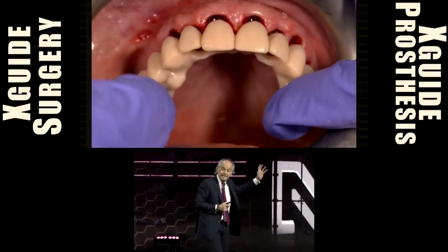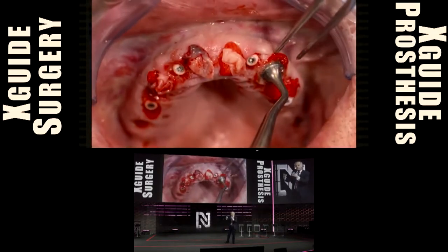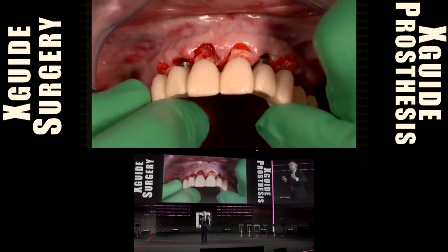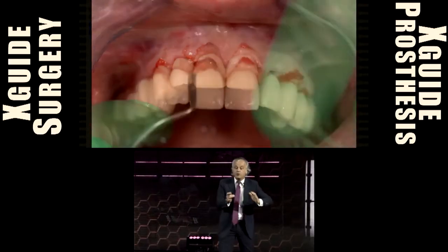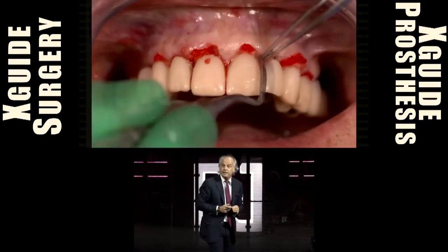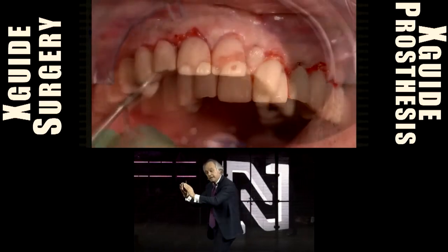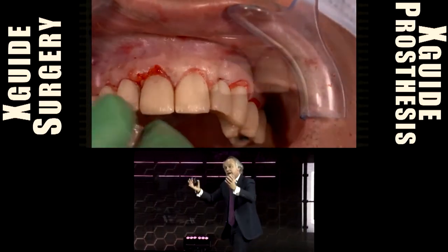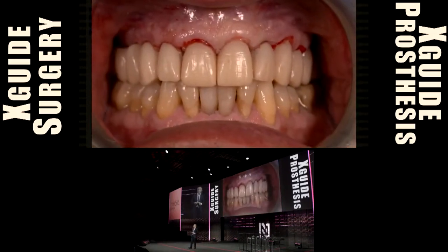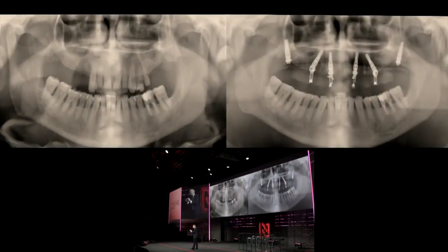Working flapless — as in this case, where we remove the teeth of this terminal dentition — we prefabricated the prosthesis that will be driven into the right position. With navigation technology we are not only preparing the implant site and the implant bed, but also the recipient site for the prosthetic pin, which simplifies the relining of the temporary prosthesis and minimizes prosthetic adjustments in the surgical theater.